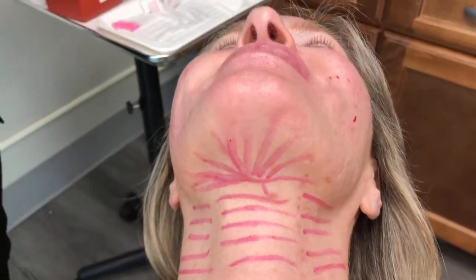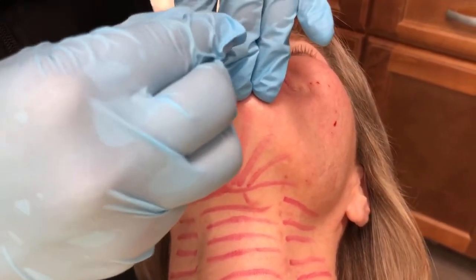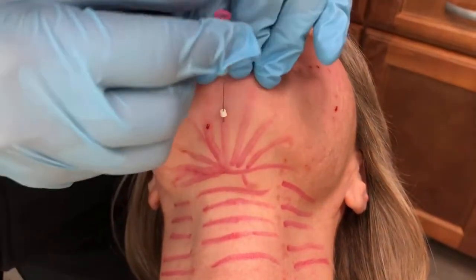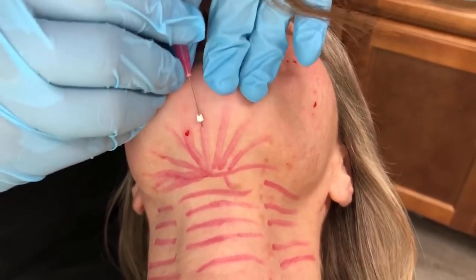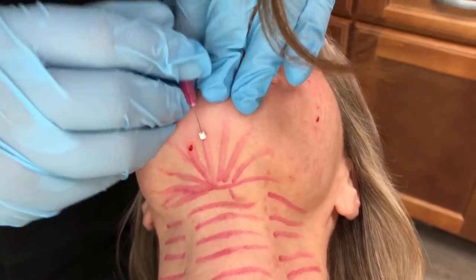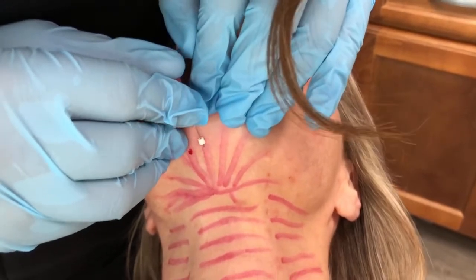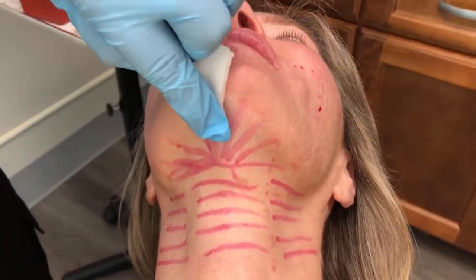We're still in the subdermal plane, but we are really aiming for the fat. You can see we are placing these at a fairly shallow angle — about a 10-degree angle as we enter into the skin. As you get through the area you want to target, you may also encounter some resistance, but you want to make sure that you're causing some trauma to the fat cells. That's exactly what we want to target here.